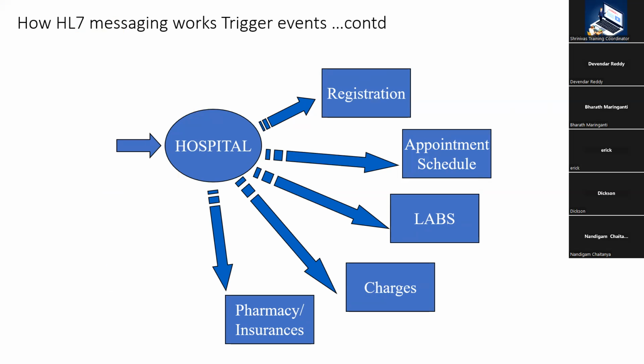Registration itself will have many events, like a patient getting registered, getting discharged, getting transferred to a different place, right? Similarly, other sections of the workflow will also have a lot of events that are happening in the real world. So we'll see a few of them tomorrow. But within today's session, we just need to have an intro to that.